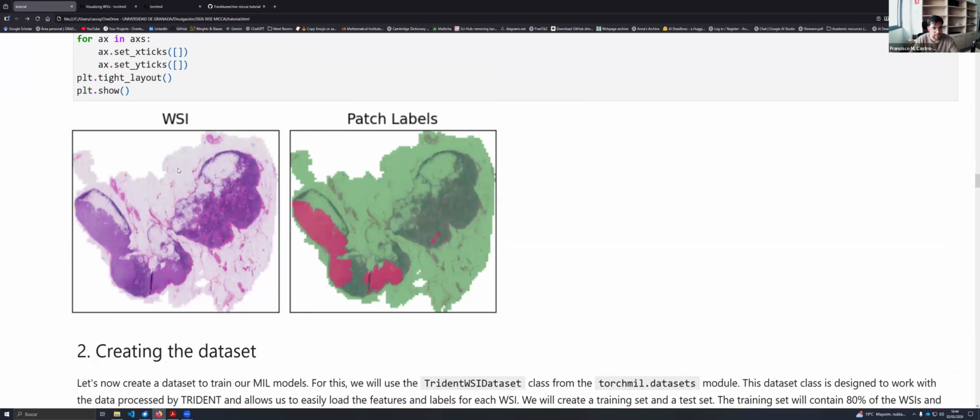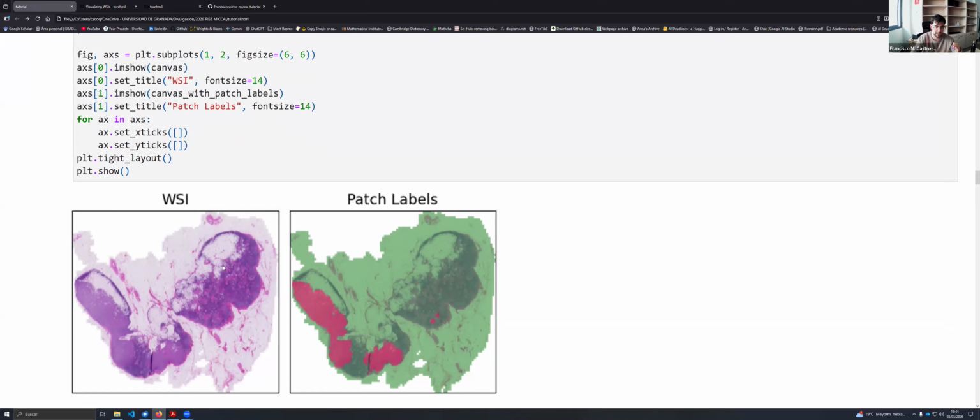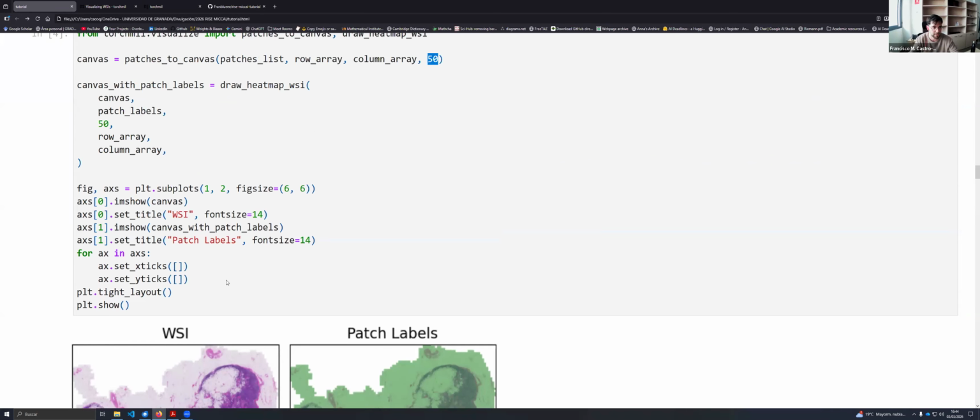And you will obtain this whole slide image. This is a low dimensional, or low quality, representation of the whole slide image. We are representing a gigapixel size image in a very small image here. This is only for evaluation purposes.